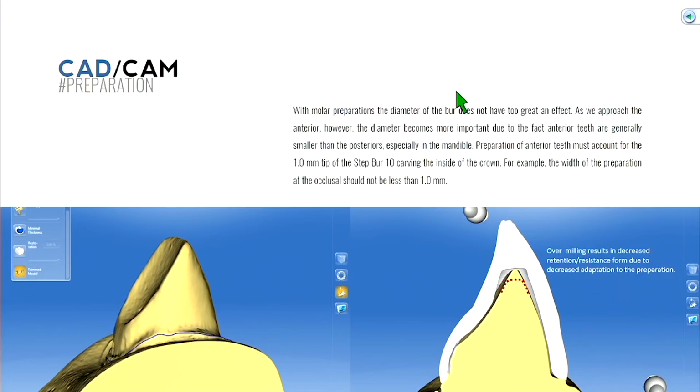So actually, when you go and start to do your design, select your slice tool and get to this viewpoint, this orientation. And you can analyze in your own design how your prep would affect the over-milling. Okay, so you kind of want to see for yourself after you've modified how much space you have there. We're trying to minimize that space. Okay.